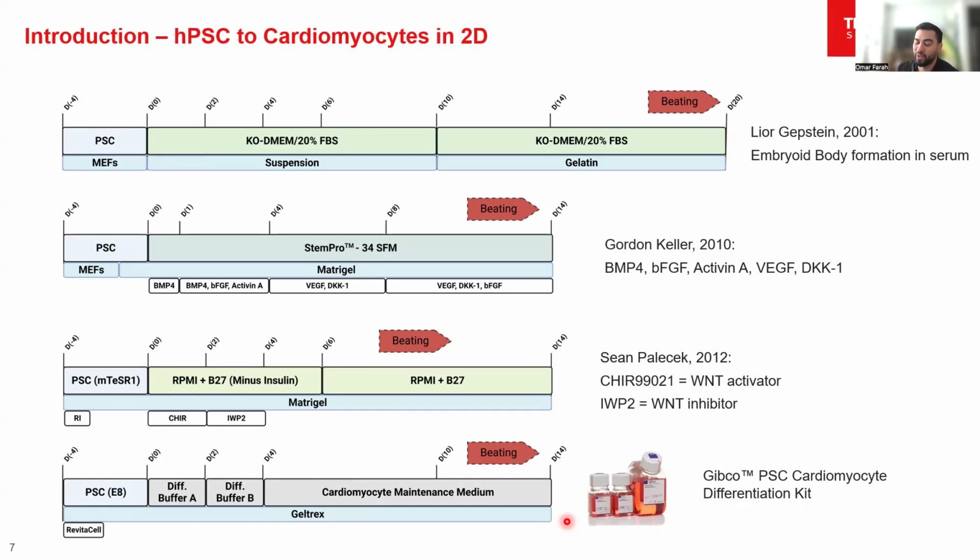Some of which we'll review together in the next several slides, Naresh, so don't worry. In terms of the first question that you asked, what's in the cardiomyocyte differentiation kit, this is a little bit more nuanced of an answer. Not just for Thermo, but generally speaking, commercially available kits tend not to advertise too much of what's inside of them, for intellectual property and commercial reasons.